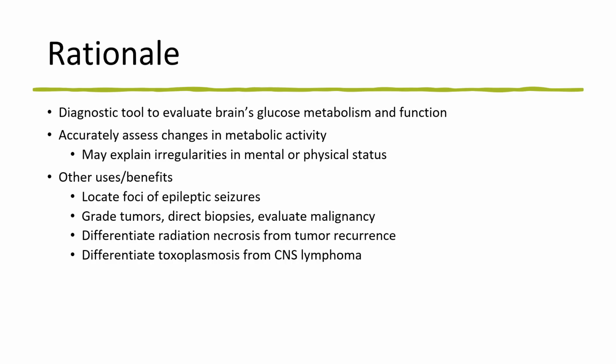Talk about the cancer stuff a little later on. Also, though, it's really good for looking at infections in the brain and looking at how that's changing the glucose metabolism. And then at the very end of this lecture, we will talk about how FDG brain scans are being used in criminal cases as well.